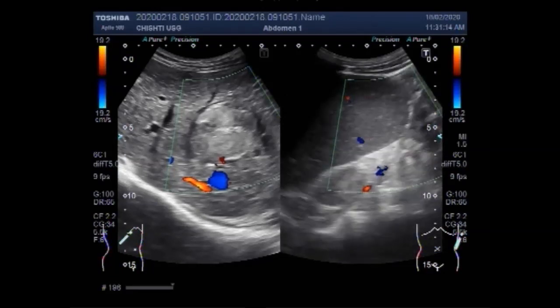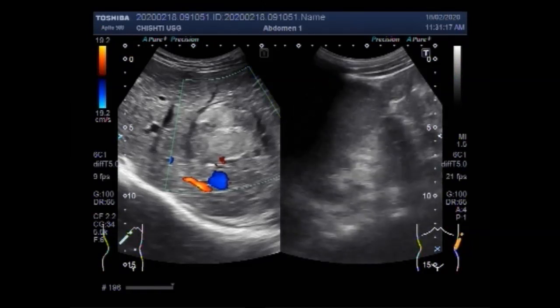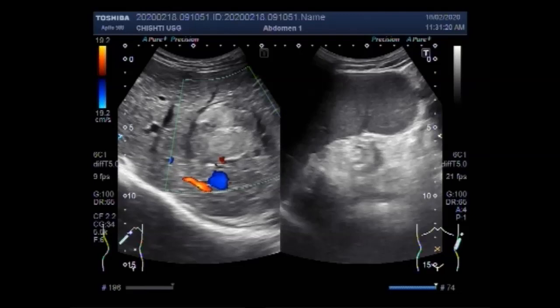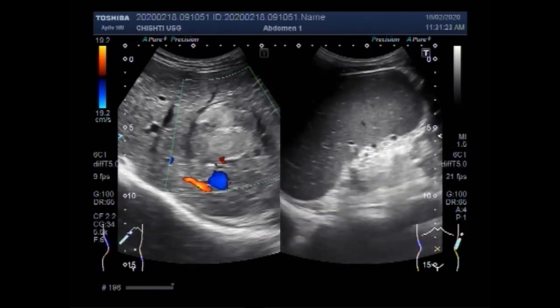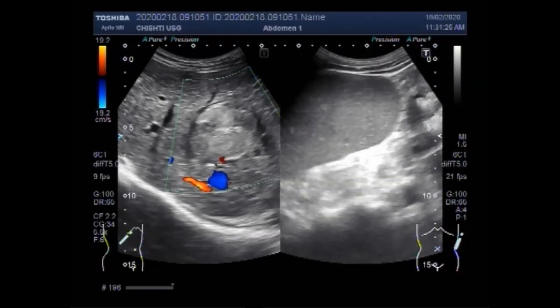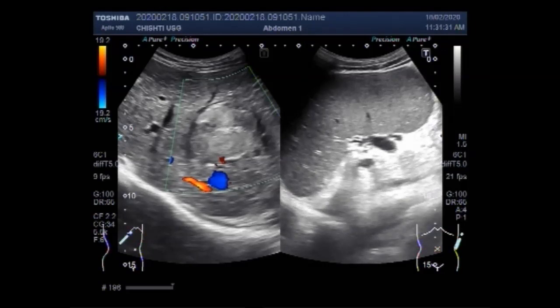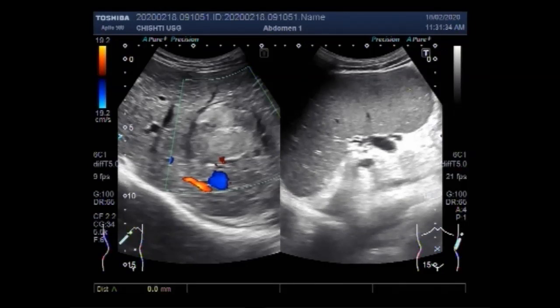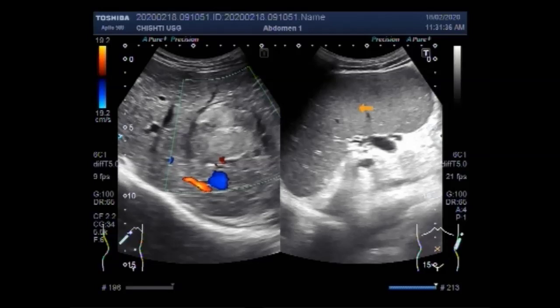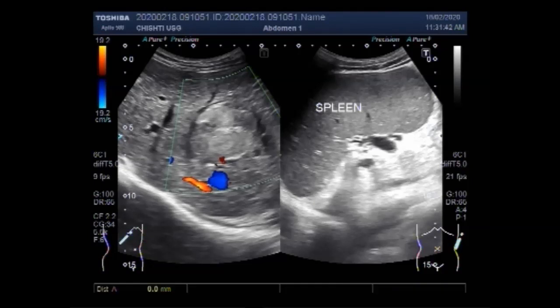Now you can see the spleen, which is slightly enlarged in size. You can see the measurement of the spleen — it measures about 13.6 cm, which is slightly enlarged.